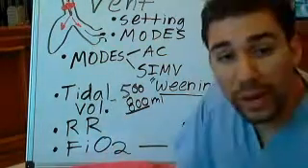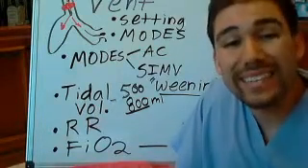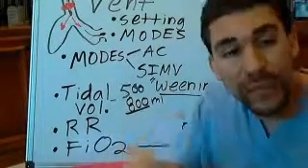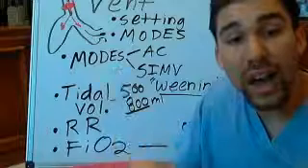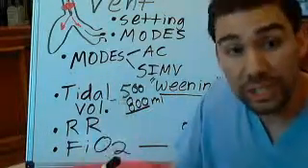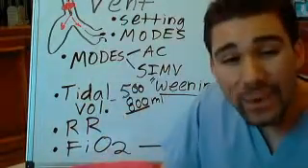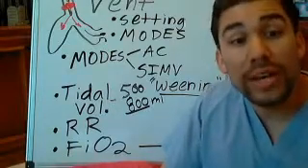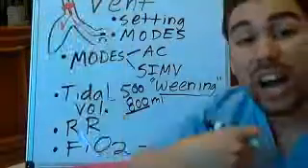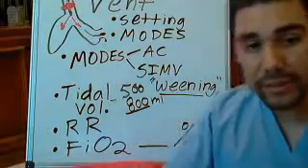Your respiratory rate should be between 16 to 20 breaths per minute. We're filling your patient's lungs up with oxygen, and hopefully that rate is good for your patient. Now, anything between 12 and 20 is adequate, but we want to make sure your patient is breathing enough, and this rate at which oxygen and air goes down into the lungs will help us do that.